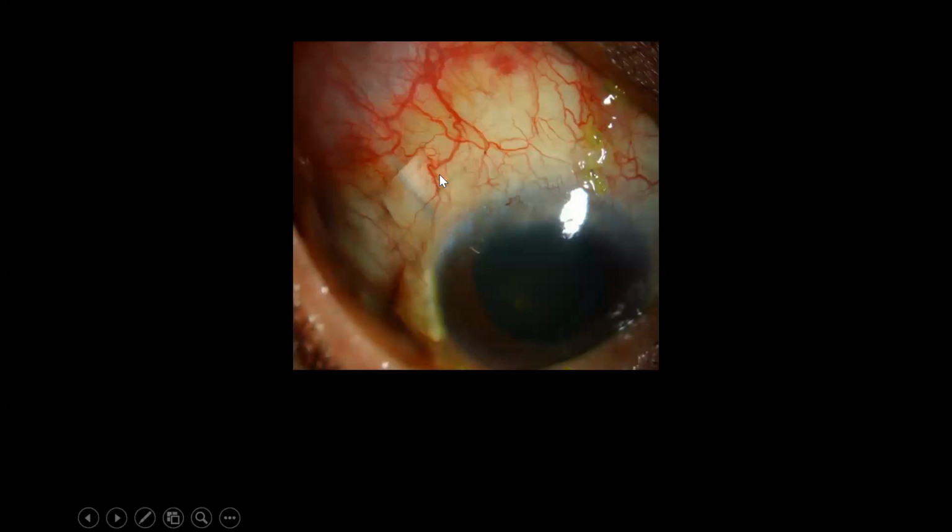So the surgeon here made a scleral flap and inserted the tube under the scleral flap, like what you do in trabeculectomy. So remember, in glaucoma drainage devices, you can have a pericardium patch graft, you can have cornea preserved in glycerin patch graft, you can have a donor scleral patch graft, or you can actually create a scleral flap if you don't have patch grafts.